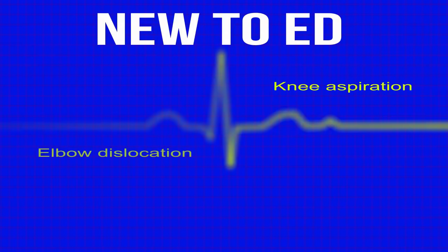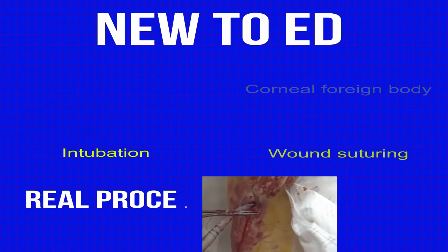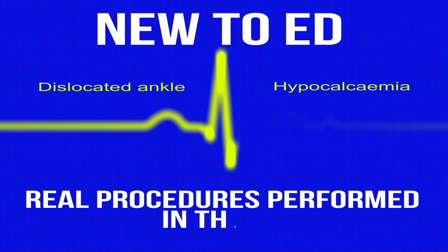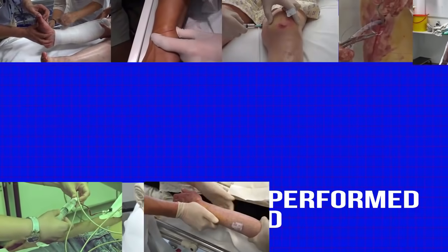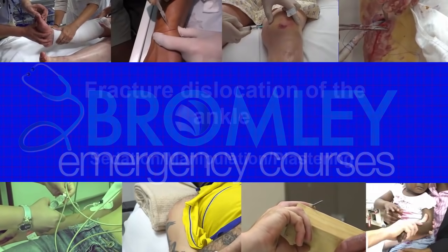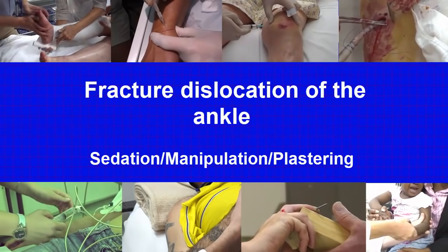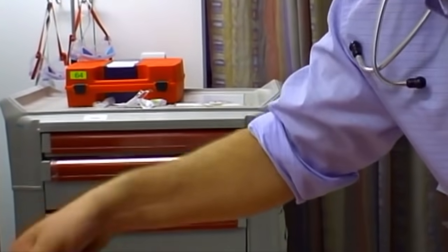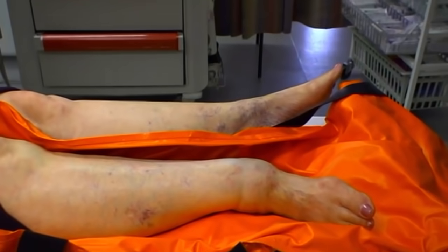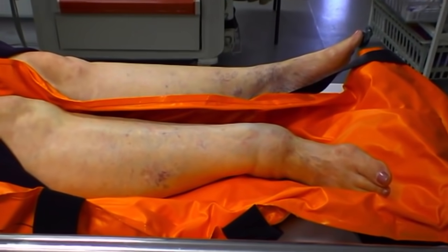I'm going to put a bit of local anesthetic in and we're going to secure the chest drain. The patient has sustained a fracture dislocation to her right ankle. She has a pedal pulse at the moment, but the ankle is deformed and we need to reduce that quite quickly. To do this, we're going to provide analgesia and sedate this lady.